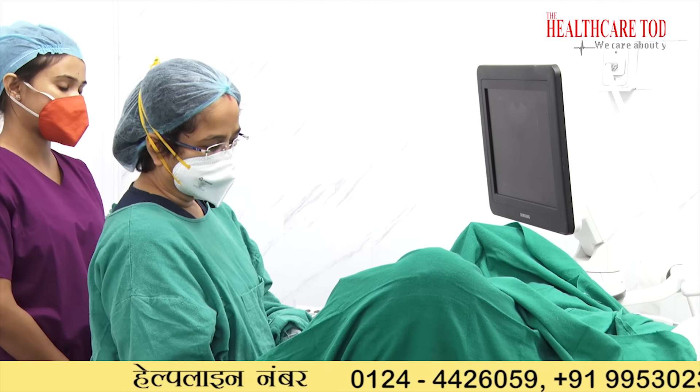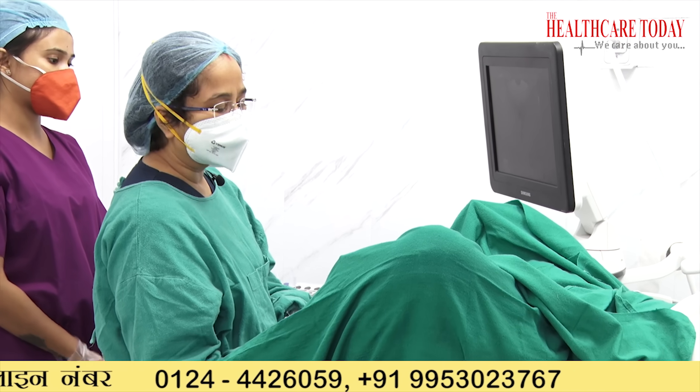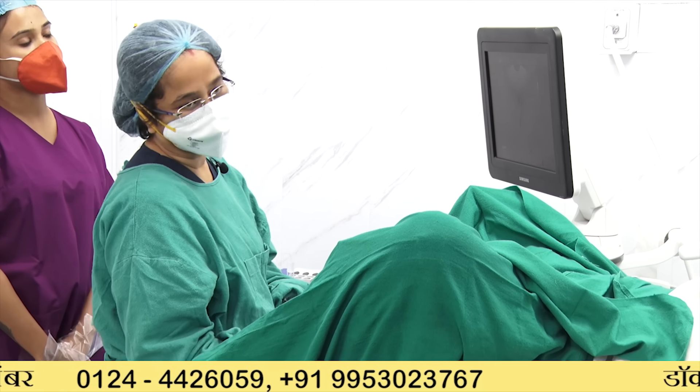We use the suction pump and collect the follicle fluid. When we collect the follicle fluid, we have to take care to see how many eggs are available.